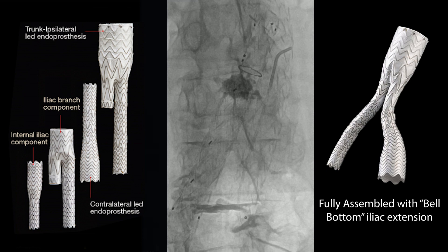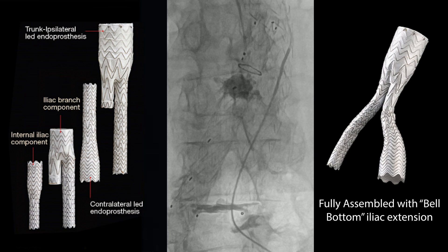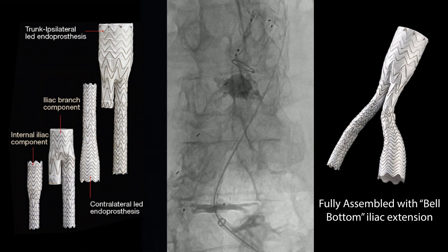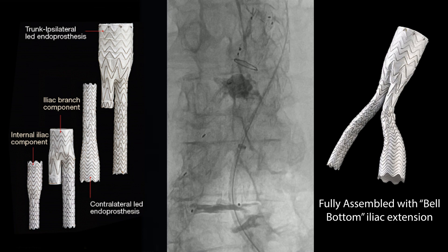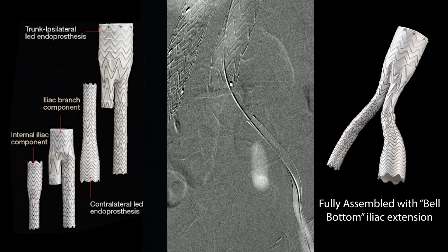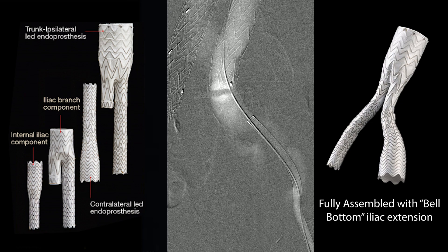Again, first step: you're going to spin the catheter, make sure that you're actually inside the lumen, then switch out to the stiff wire, and over the stiff wire we're going to bring up the sheath. You can see this patient has had multiple injections into their lumbar vertebra for osteoporosis. What's now happening is we're bringing up a stiff wire and bringing the sheath up inside the left iliac limb. Once we remove the dilator for the sheath, you're going to pull that back down so we can mark exactly where the origin of the hypogastric is.